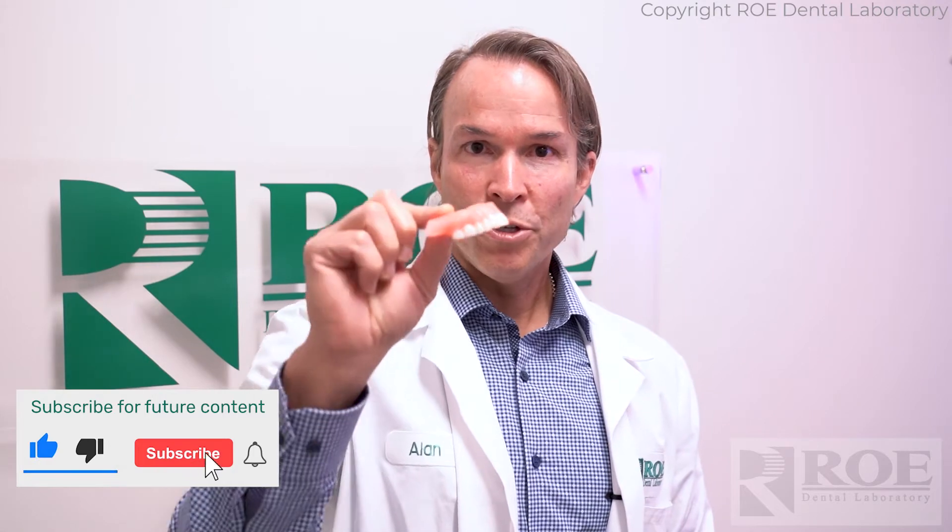If you have a CBCT scanner, the easiest way to make a duplicate denture is to take a CT of it. All you do is set it on the foam, scan it, and upload the DICOM to us.